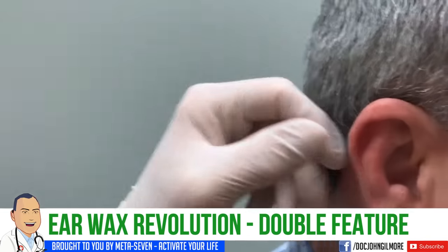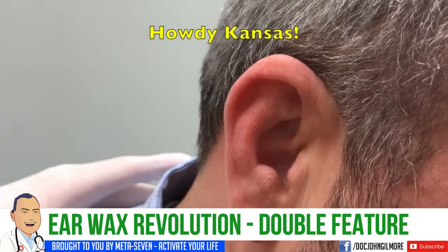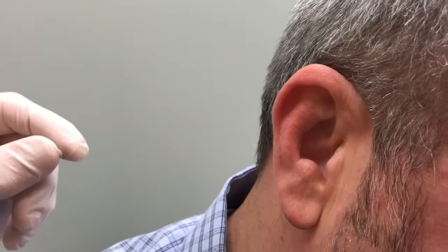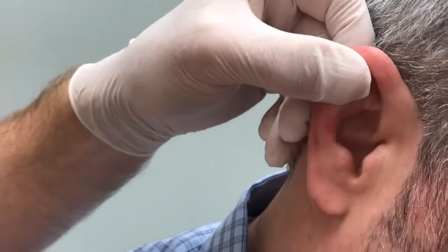We're not going to show your face, we're just going to show your ear. You've never had anything removed from your ears before? Nope. Can you hear me? Yes. And you've had trouble hearing out of this ear for some time. I haven't thought I had a hard time hearing — recently it's come to your attention there might be an issue. So what we've decided is that you have a great deal of cerumen impacted in that ear.